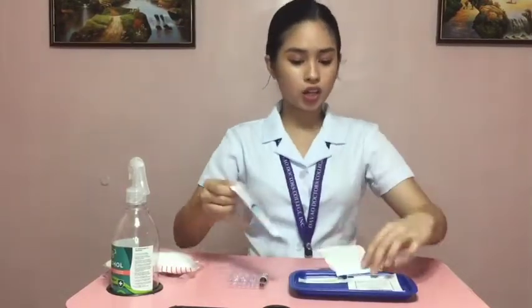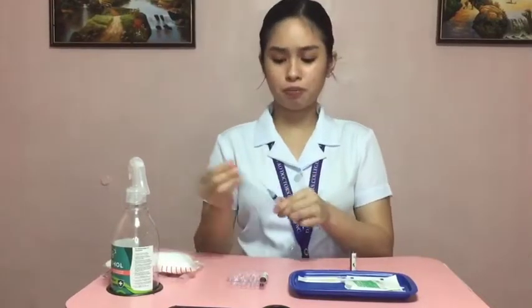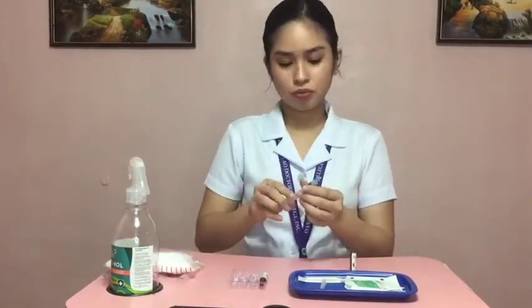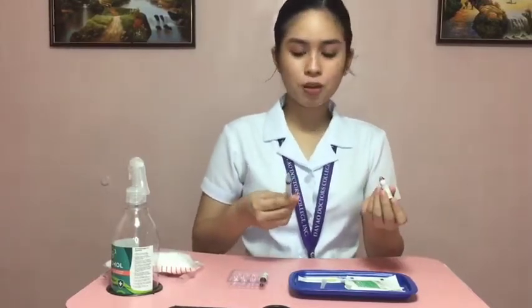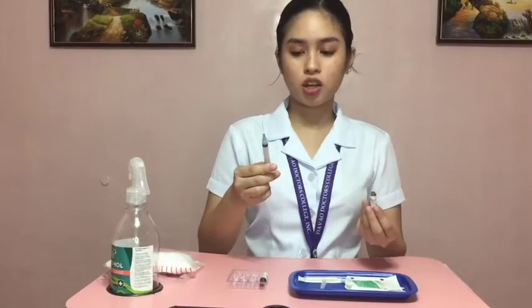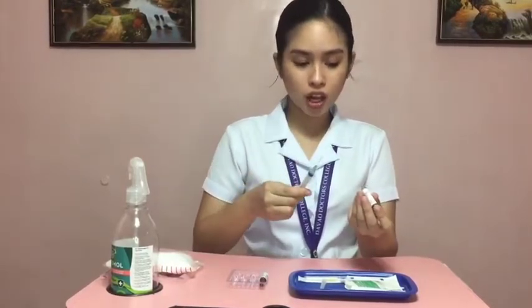So now let's proceed with drawing the medication. Place the ampule on a flat surface, and of course let's proceed opening the syringe with a filter needle. Then remove the cap. Now let's hold the ampule slightly and insert the needle, avoiding the tip of the needle touching the rim of the ampule.